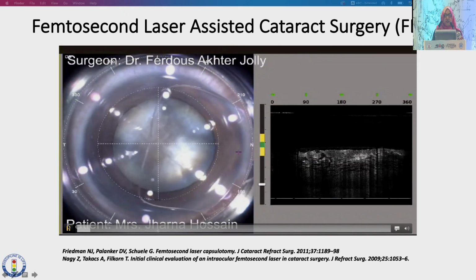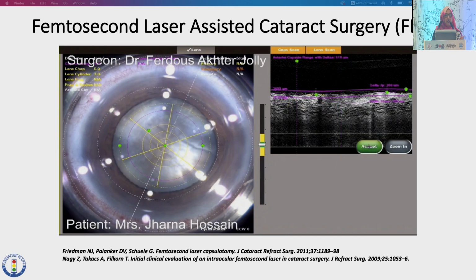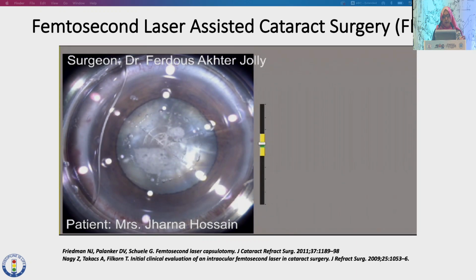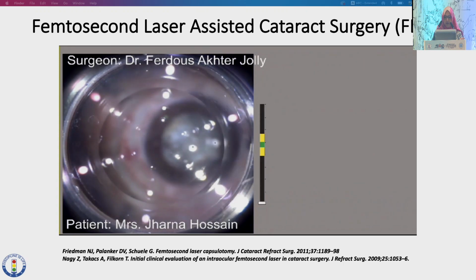Femtosecond laser-assisted cataract surgery paved the way to a new era, especially in white and hard cataract, to achieve the desired capsulorhexis. This technology gives more consistent outcomes than are achievable by an experienced surgeon. There is less variation in centration and size, uniformly circular and precise diameter, reduced risk of radial tears, and optimum capsule overlap. Therefore, refractive and visual outcomes improve due to more predictable effective lens position. Higher cost of the procedure remains the major limiting factor.